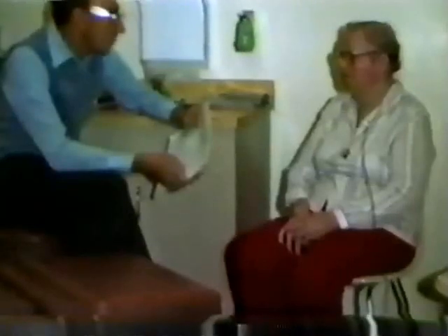Esther, since your skin cancer is so large, we're going to be taking it off by an unusual and a relatively new procedure. Your skin cancer measures approximately 2 by 2 inches, which is rather large. Today what we're going to do is we are going to freeze the area around it with some xylocaine, and when I use the word freeze, I really should say numb. After I numb the area, we will scrape out all the cancer we can feel, and then we will freeze the area with liquid nitrogen. This will be frozen to about 40 to 50 degrees below zero.